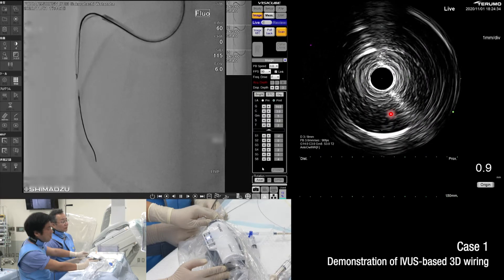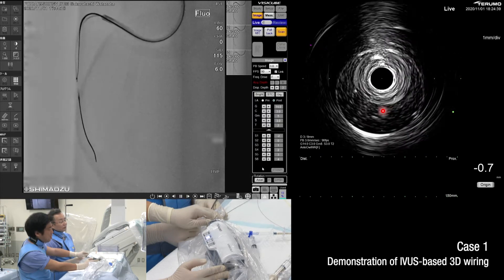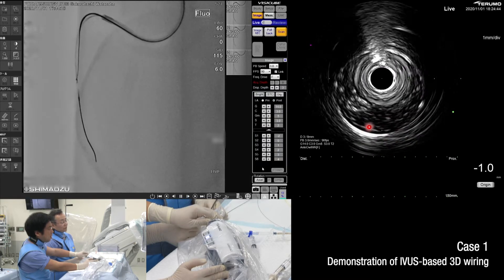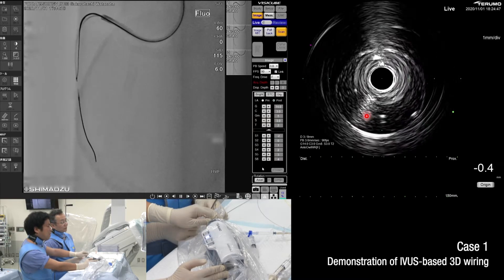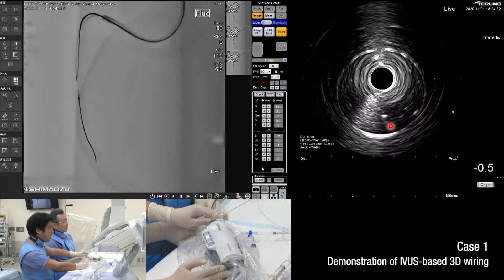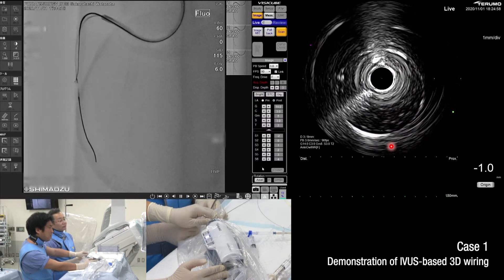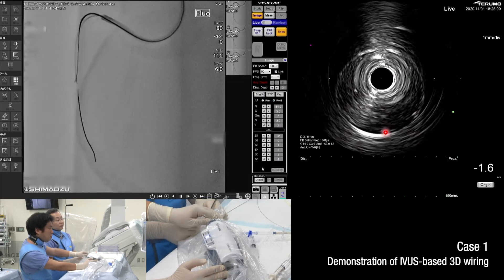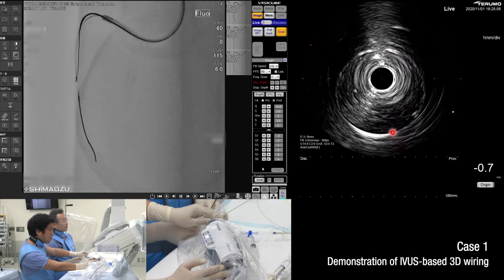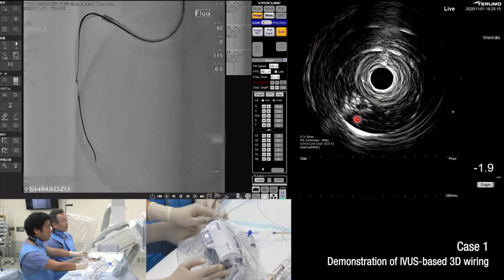Just now it was rotated clockwise. The shaft is at the transducer. The direction is 7:30 — the target is here. This direction is okay, or a little bit counterclockwise to the center part of the target. A little bit more counterclockwise. You can now see the guide wire tip is on the target.